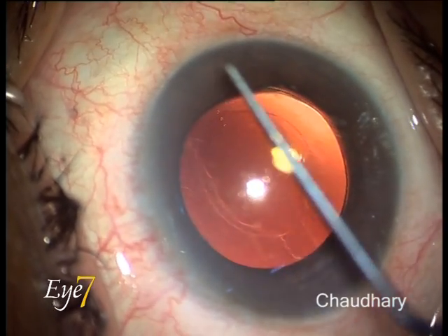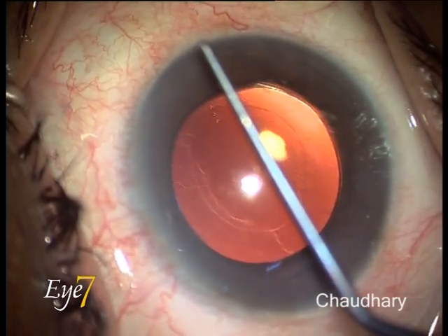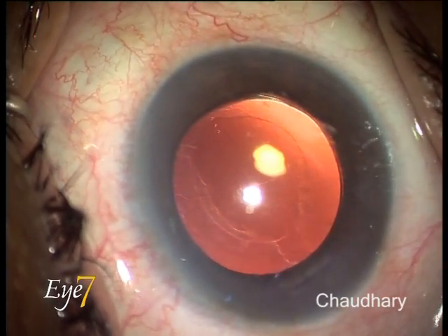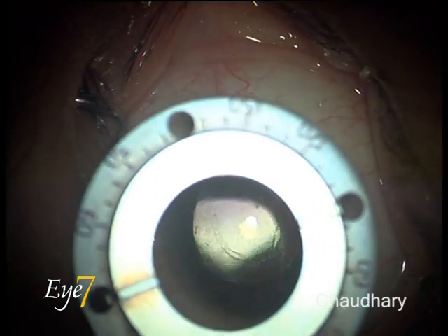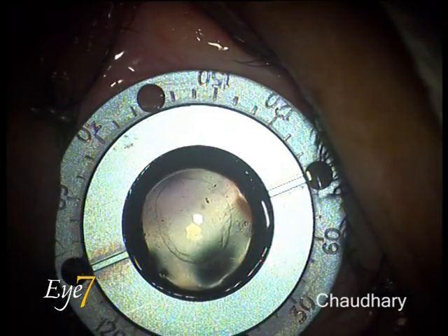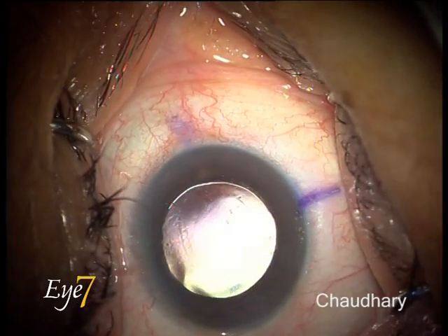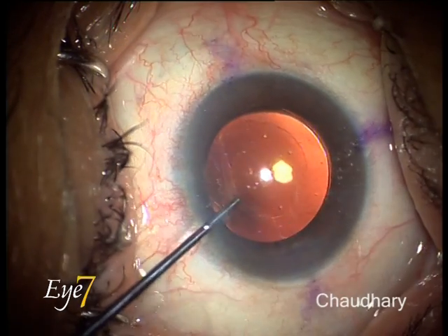The pre-existing cylinder of two diopters, which was supposed to get corrected by the Toric IOL, had doubled to four diopters. We checked our data and found that during calculations, some of the K1 and K2 readings had got interchanged, leading to the placement of the Toric IOL at 180 degrees, whereas it was destined to be at 90 degrees. So we decided to rotate the lens to the 90 degree position.